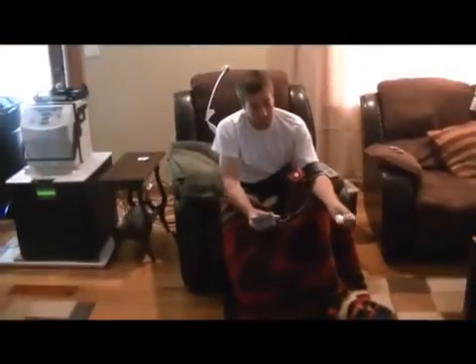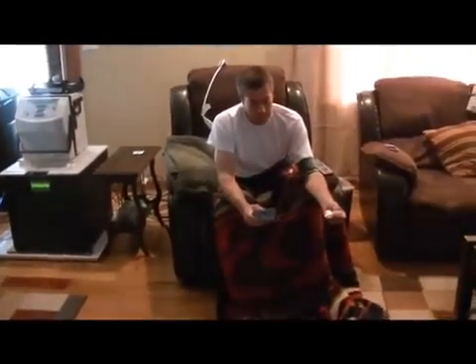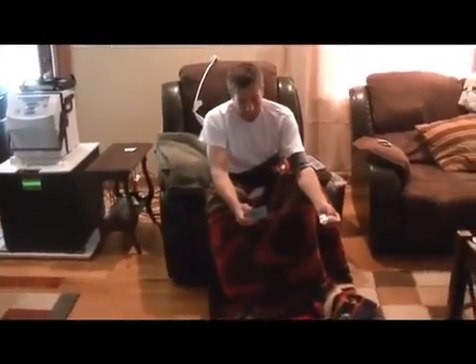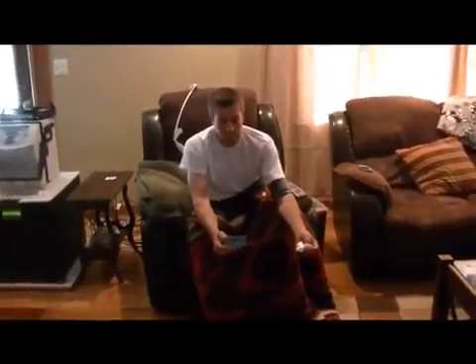At the end of the treatment, we have to check his blood pressure again, his temperature, and he does a post weight, and we'll record all that on the sheets, and that basically wraps up our home dialysis treatment.